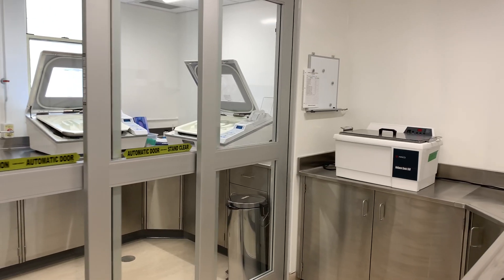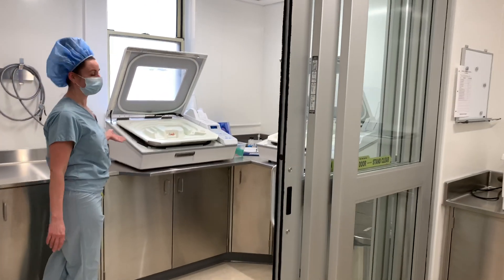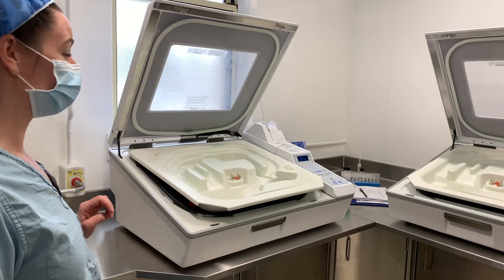After manual cleaning, they will bring the scope over to our processors in this room. These machines take approximately 30 minutes to sterilize an endoscope.